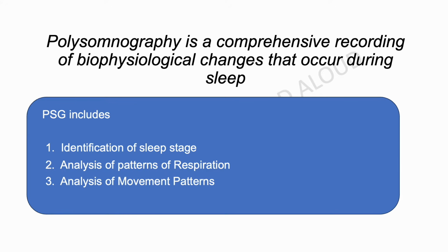So amongst the biophysiology in sleep, what we are looking at as pulmonologists while reporting is mainly, number one, identifying how the patient's sleep is, the overall quality, architecture, staging of the sleep, analyzing the state, the patterns of respiration, whether the patient has any sleep related breathing disorders, and also trying to analyze other problems such as movement disorders or any other neurological issues that we can come across.